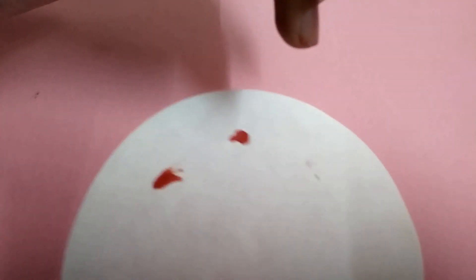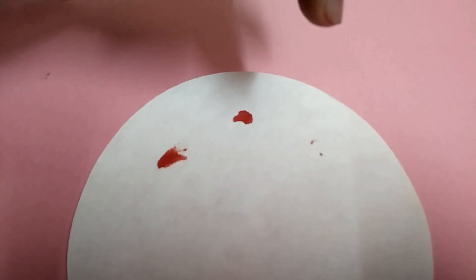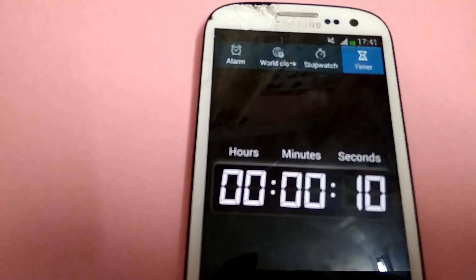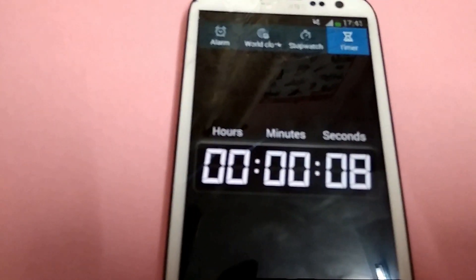Don't confuse with the timing, because the timer was set from ascending to descending order — that is, 30 to 0 seconds.